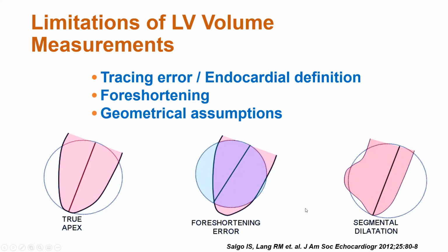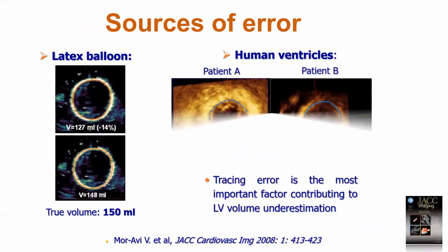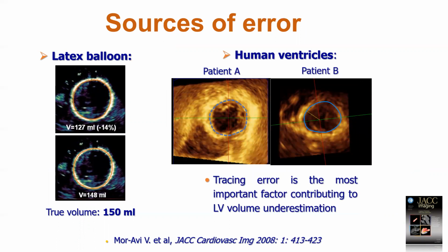but three-dimensional echocardiography is imperfect as well. It gets closer to the MRI reality, but it's not a perfect measurement either.